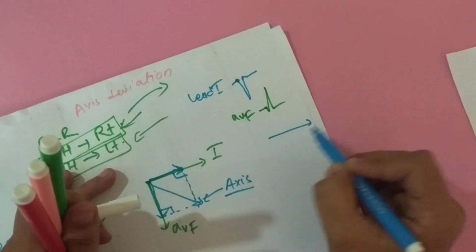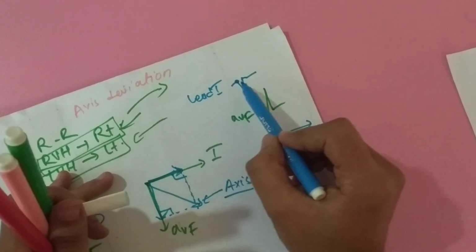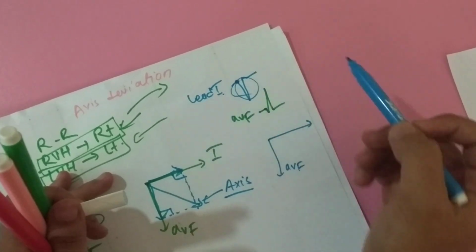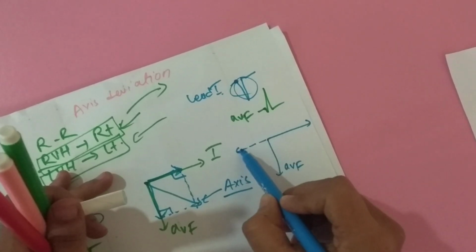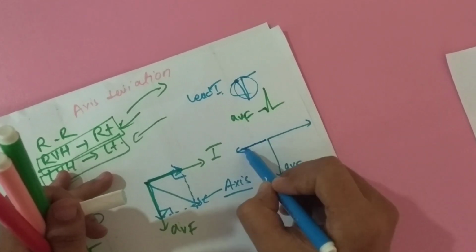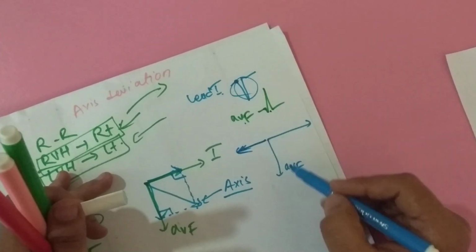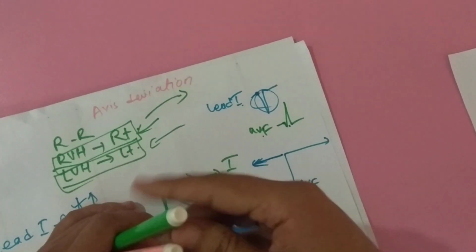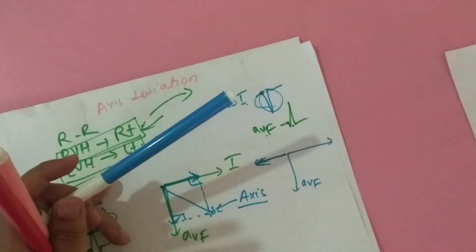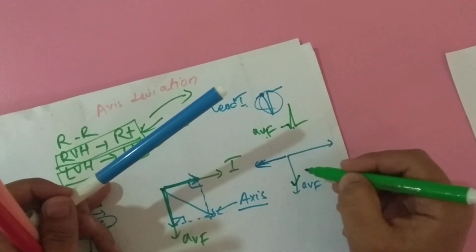So this is lead 1 and this is AVF. You see here, in lead 1 it is a negative deflection, so the vector would be in this direction, so it is negative. So this is our lead 1 vector representation, which is negative, whereas in case of AVF it is positive, drawing it till here.